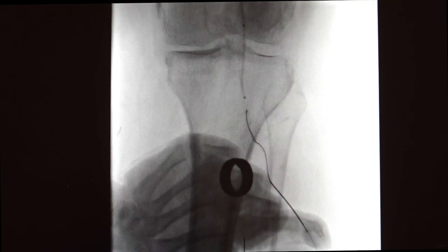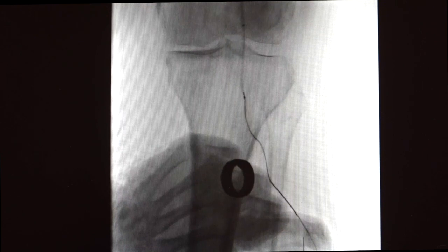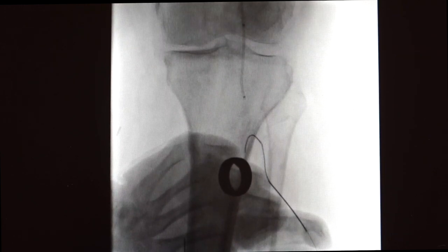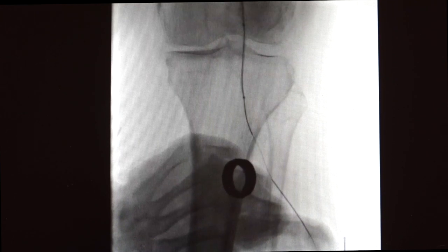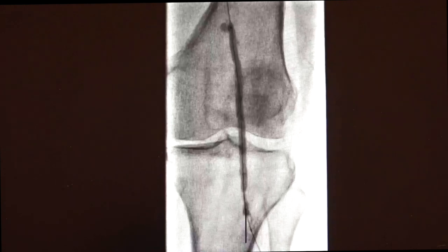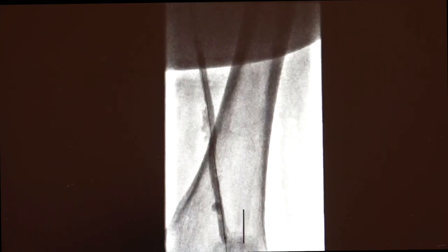Since dorsalis pedis access on the left was not successful, we decided to achieve left anterior tibial access under fluoroscopy using micropuncture. There was a Navicross catheter in the popliteal. We were able to get access and advance a Platinum Plus wire up to the Navicross and externalize it, creating a firm rail to work from the antegrade left brachial sheath. We placed a hemostat at the skin level to maintain that firm rail, which allowed us to advance a 5 by 120mm balloon further down into the popliteal.